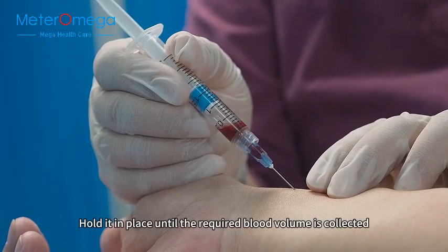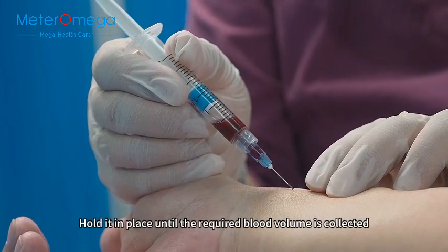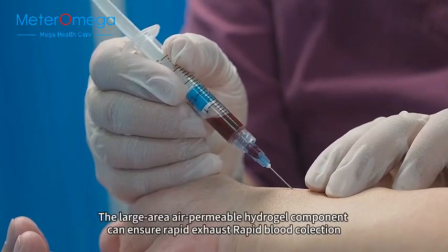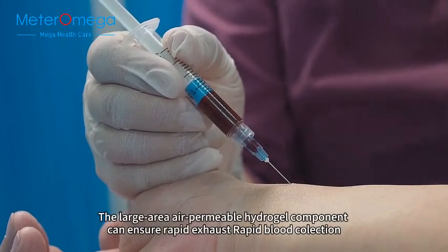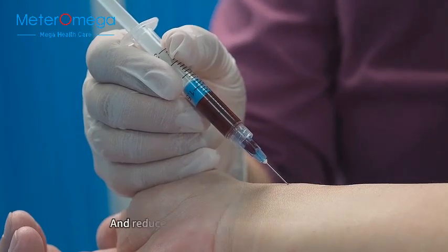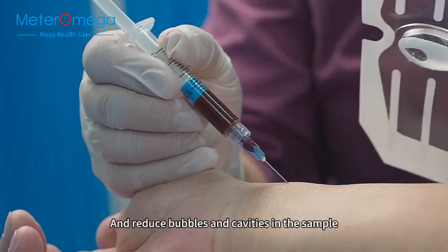Hold it in place until the required blood volume is collected. The large area air permeable hydrogel component can ensure rapid exhaust, rapid blood collection, and reduce bubbles and cavities in the sample.